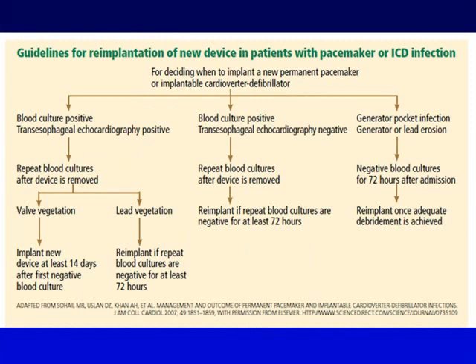When you implant the new device after taking the old one out, once again, there's a nice algorithm, which I'm not going to go through all the names on, but you can see that it's pretty clearly delineated for everybody. Basically, the tendency in recent years is not to wait for weeks and weeks of antibiotics, but to wait for a period of time after you've taken out the old one, the patient's been on antibiotics for that, and then has no positive cultures, and it's usually 72 hours to a little bit more.